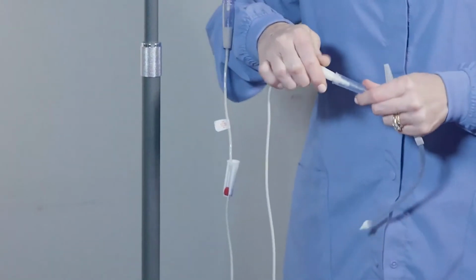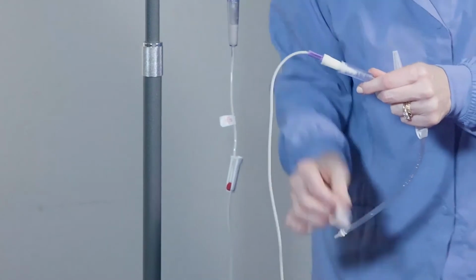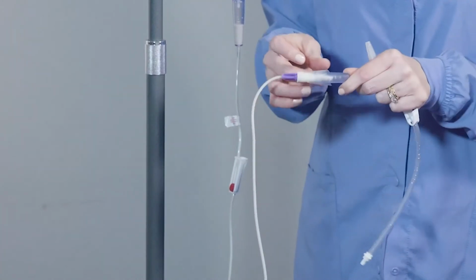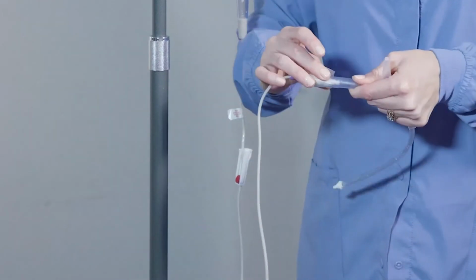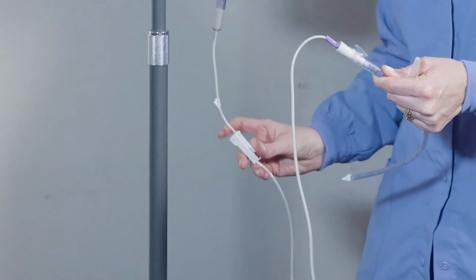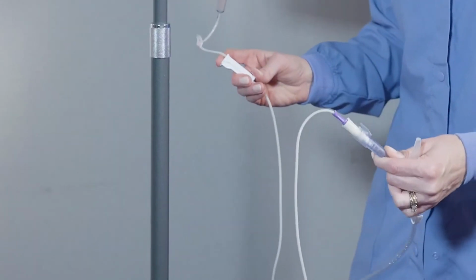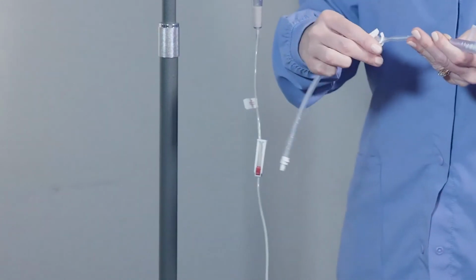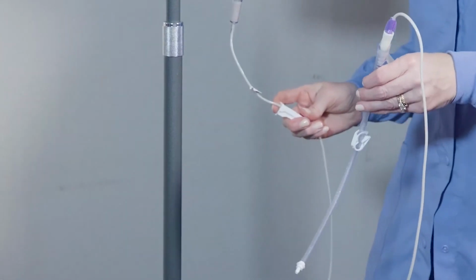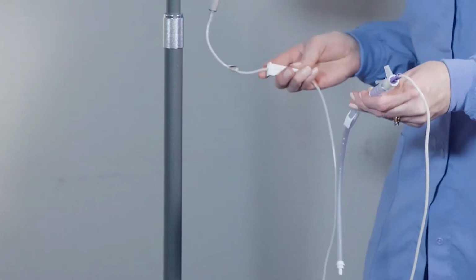Next, connect the tubing to your feeding tube or attachment device. Make sure the tubing is securely placed in your feeding tube to prevent formula leaking. You may need to secure the tubing with a piece of tape. Unclamp your feeding tube or open the attachment device valve. Slowly open the roller clamp to adjust feeding rate as instructed by your nurse.